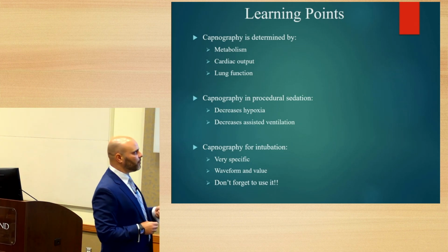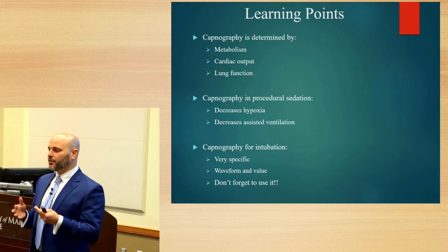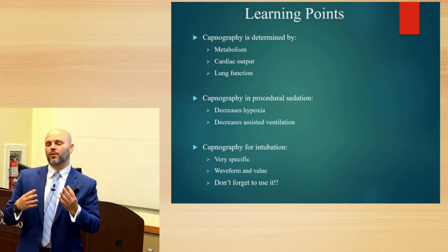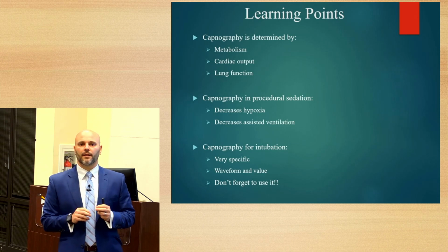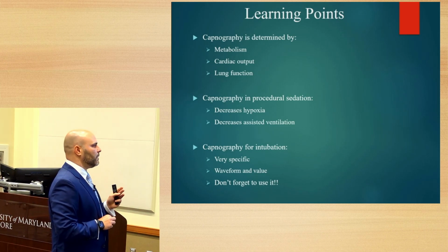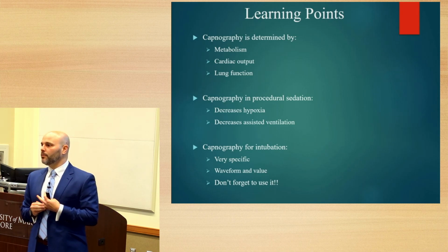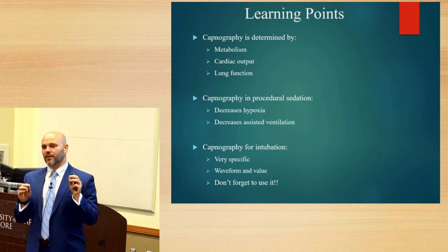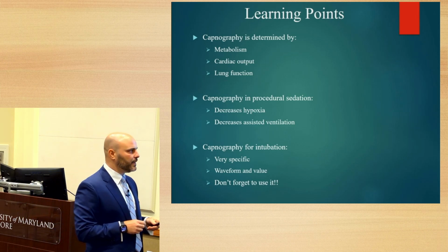We'll start off by talking about procedural sedation, where capnography will help you catch hypoxic episodes and prevent the need for ventilation assistance. During intubations, it is widely recommended that we utilize capnography for confirmation and monitoring of tube placement.